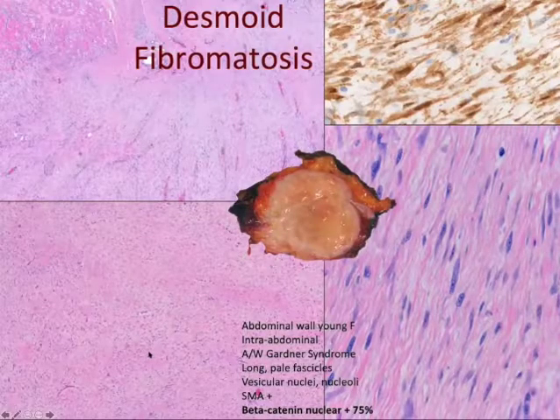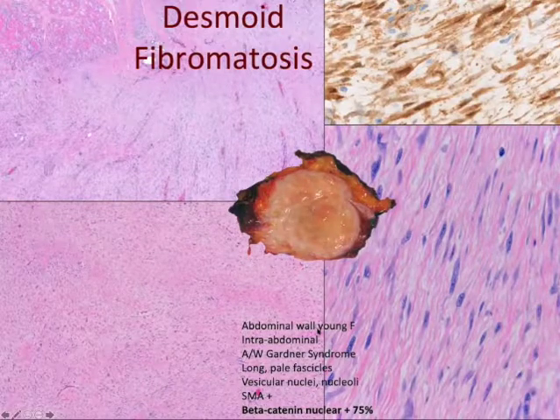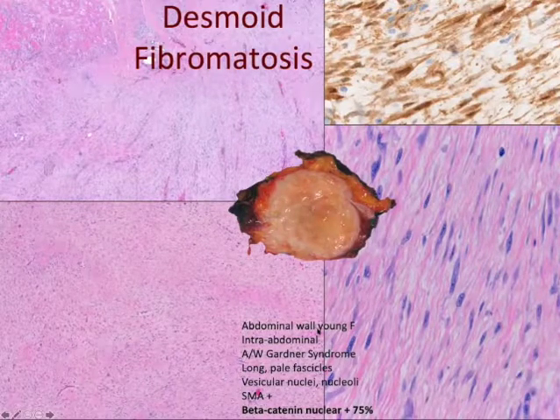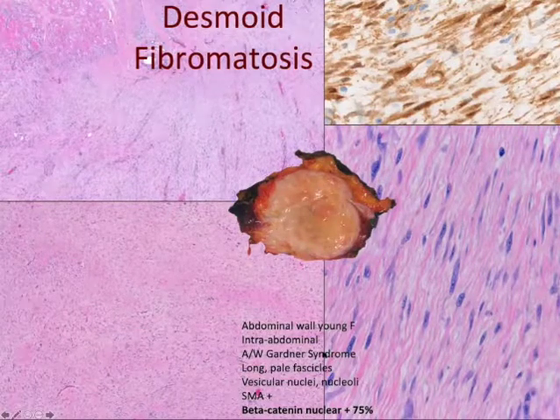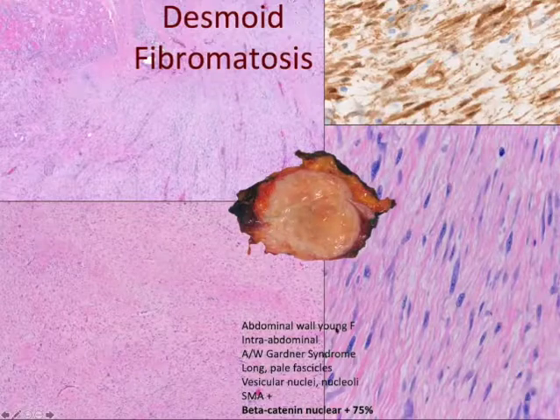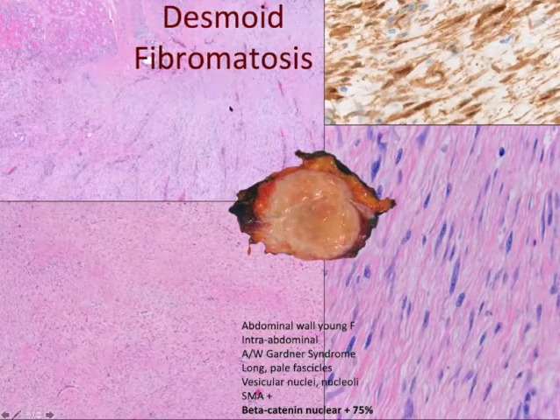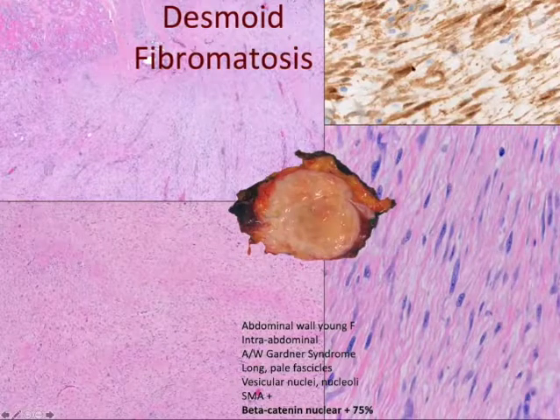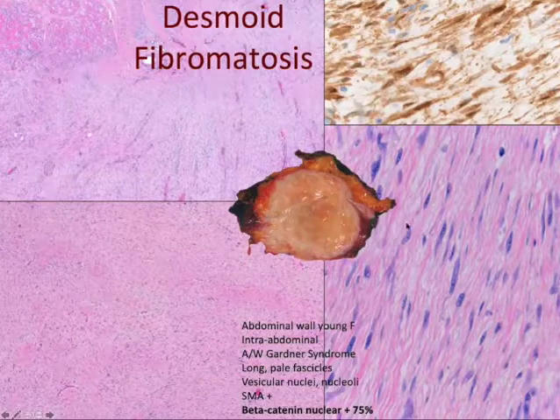Desmoid, right? We see desmoid not infrequently, often in the abdominal wall of young pregnancy age or post-gestational females, sometimes associated again with Gardner syndrome, right? So what do we think? Beta-catenin. So long, sweeping pale cells and fascicles with compressed blood vessels, as seen here, with beta-catenin in the nucleus, right? In the nucleus of these tumor cells.